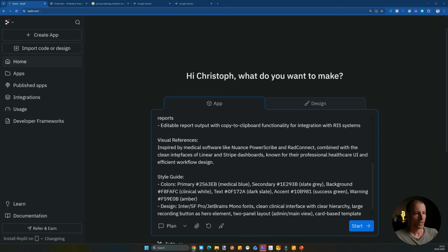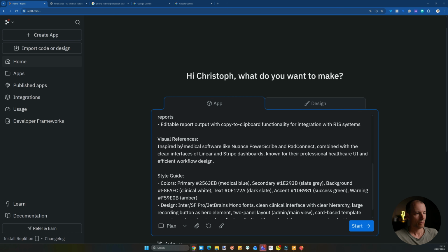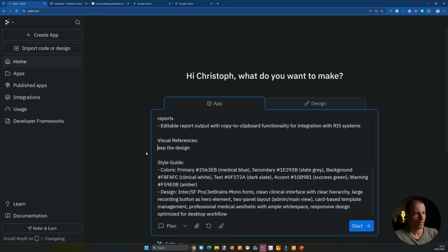So everything here you can read, visual references. So it uses keep the design. I don't want to copy them, so I don't like it. So we want to have keep design and user interface super lean and modern. Use a dark gray mode as in modern radiology apps.